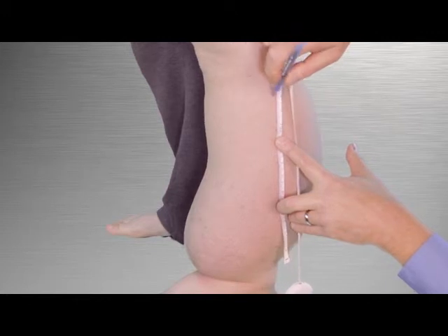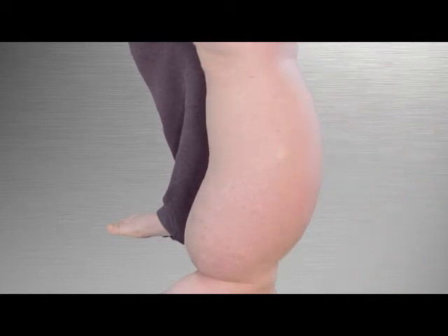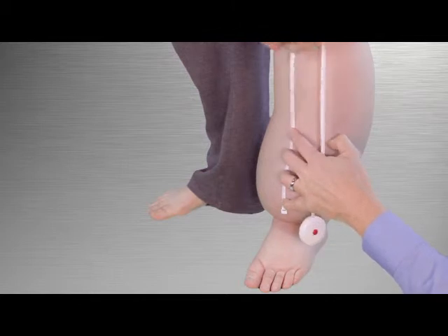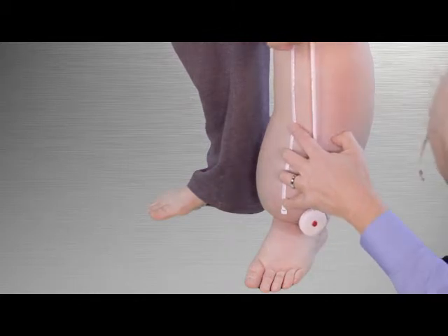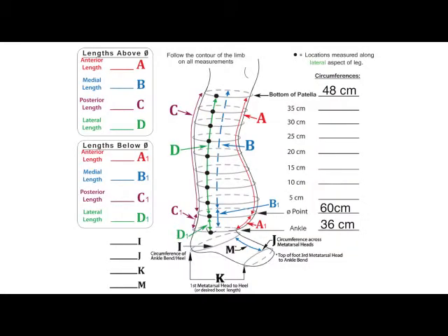In this example we stop at 25 centimeters because the 30 centimeter line would fall above the mark made for the top of the garment. Measure up from the zero point on the front aspect of the leg to the respective mark for the top of the garment, and record this measurement on the measuring form line titled A anterior length in the above zero column.